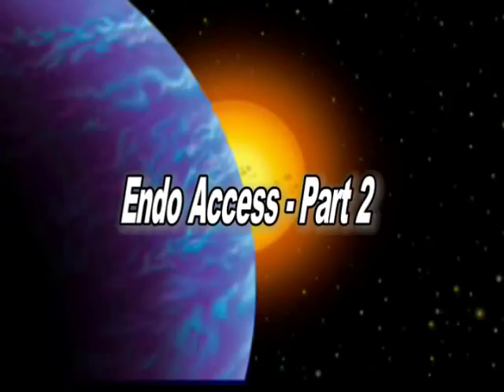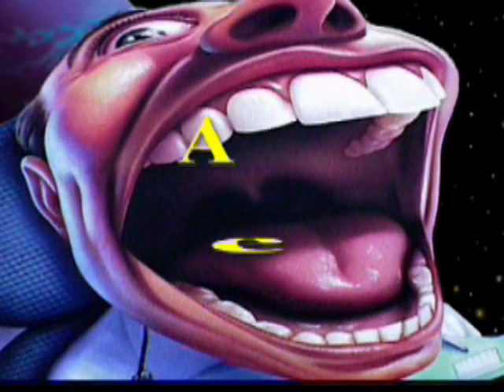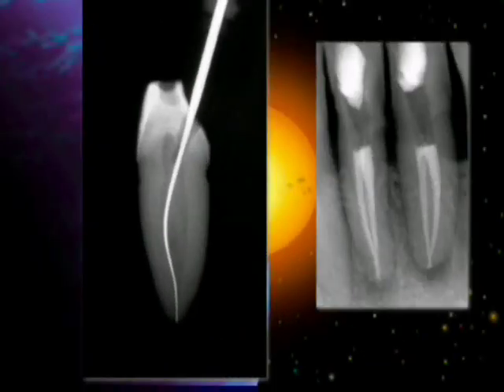Okay, here's a couple of tips to improve your access. Now, if our patients could open their mouth this wide, access probably wouldn't be much of a problem, but obviously they can't. And what we've had in the past is a cingulum access, which is a very small little triangle, and in the event that there's more than one canal, as we see here, it's very difficult to get back into that lingual canal.